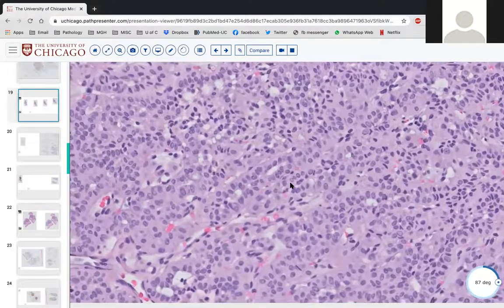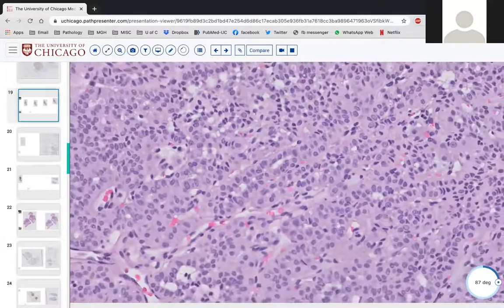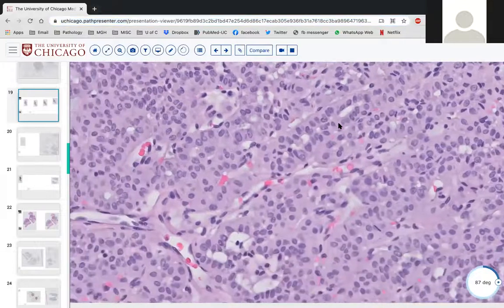Okay, so then did you want some stains, or are you ready to call it something? Oh yeah, so I thought of mucoepidermoid carcinoma. Okay, so starting with mucoepidermoid carcinoma, how many cell types does that have? Wow, it has 3, but I don't think this is it. Yeah.